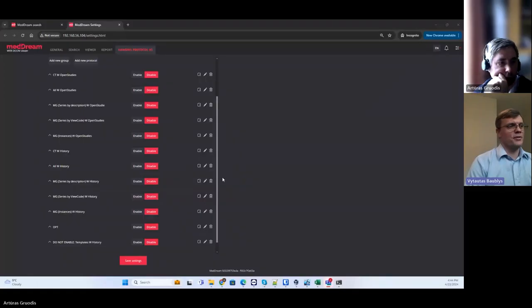So this is really good news for all our customers who are waiting for the performance, and thanks to all our partners who helped us to improve it and to make it more efficient and faster. I even saw some of our partners who really put a lot into this functionality and even into this version. So many thanks everyone for this help.